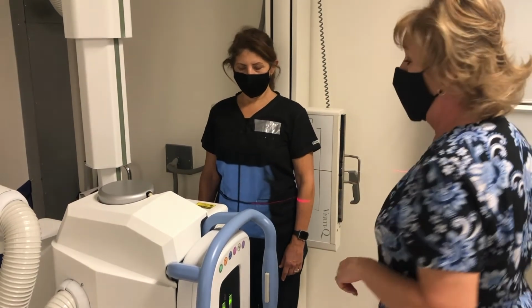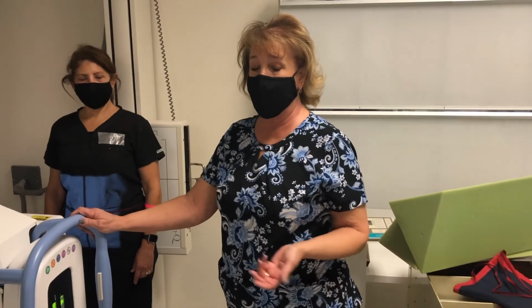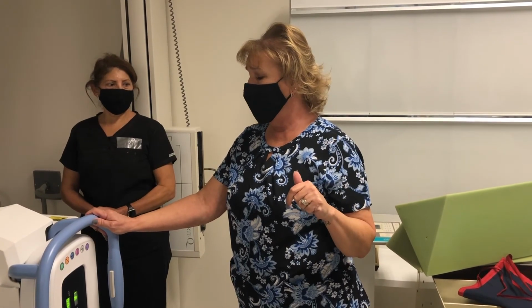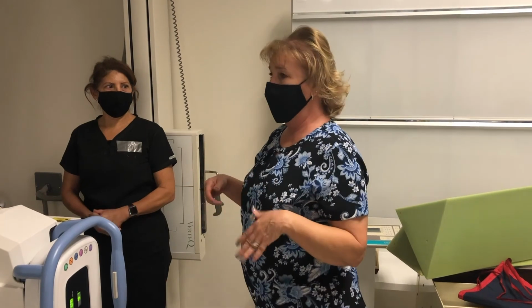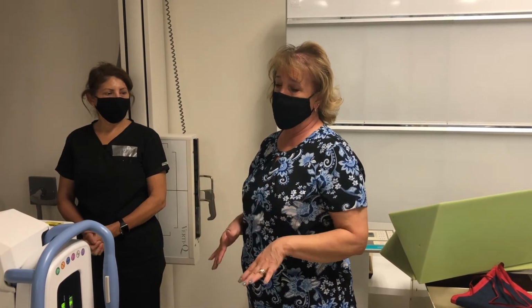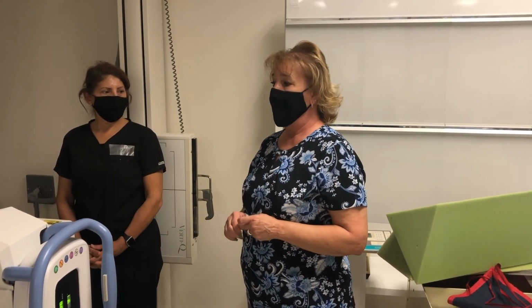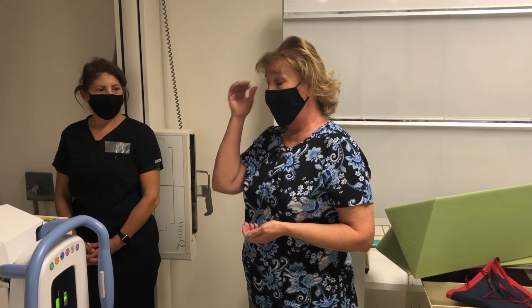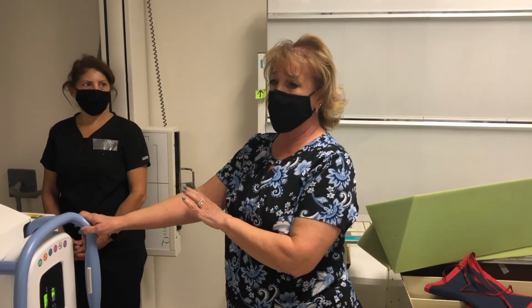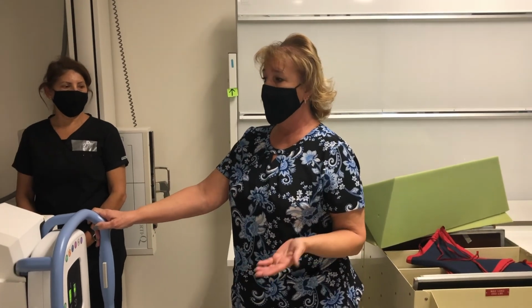Okay, I would have the patient take a seat while I showed the final imaging to the radiologist. If everything looked good and he didn't want any further imaging, most likely the department has some type of post-procedure instructions to give to the patient, telling them to increase their water intake to flush the rest of the contrast out of their system. If they're feeling any kind of symptoms at all, they should contact their physician immediately. But generally by this time, it's been 30 or 40 minutes. If they were going to have a contrast reaction, it most likely would have happened by now.